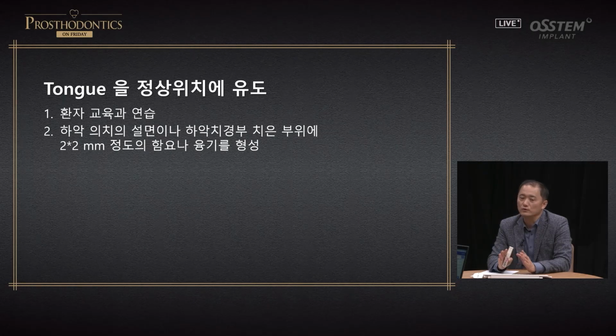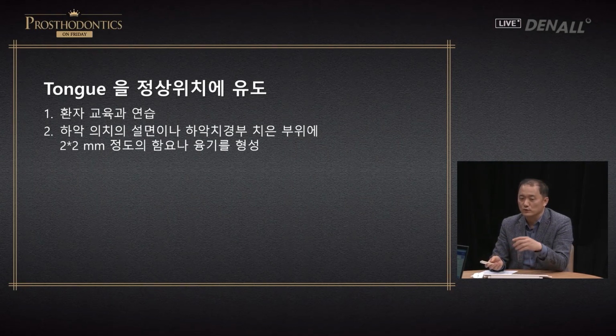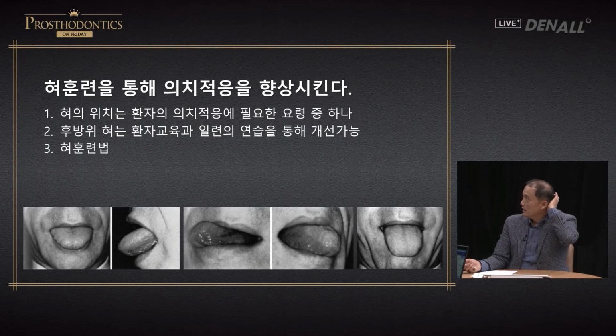But anyways, we know the importance of the tongue, but we don't really know how to use it. Not only dentists, but sometimes patients do not feel the senses of the tongue. So there is even a paper on how to train a patient to use the tongue. If you create something convex on the lower jaw, or some convex or concave area, the tongue will go there. So putting that on the anterior side helps train patients.